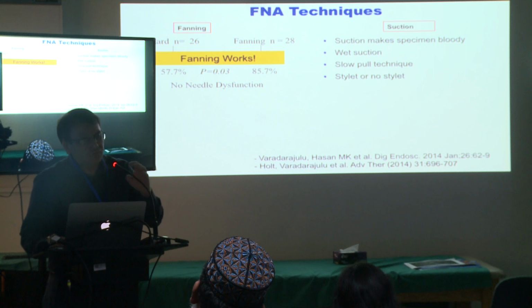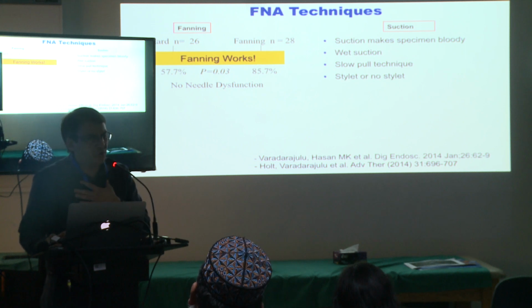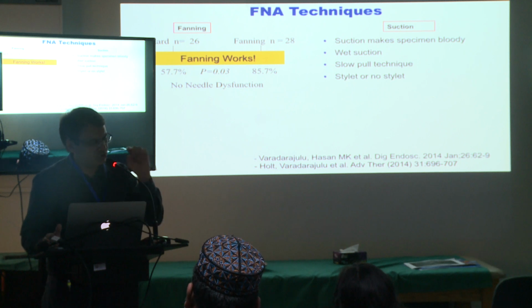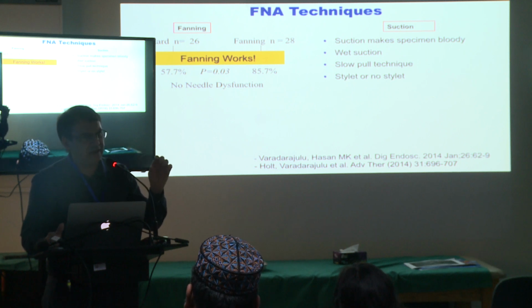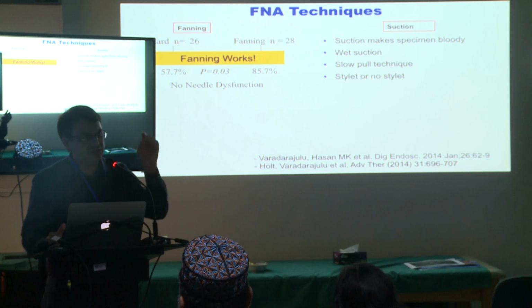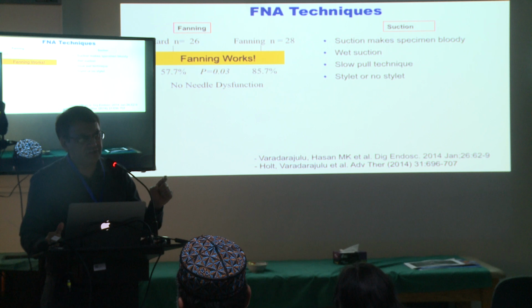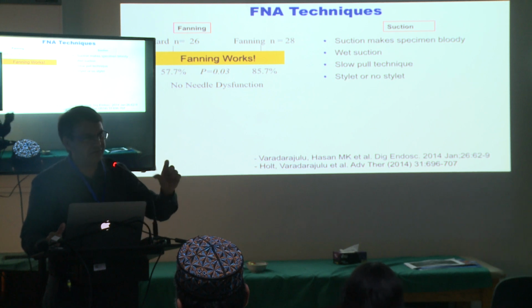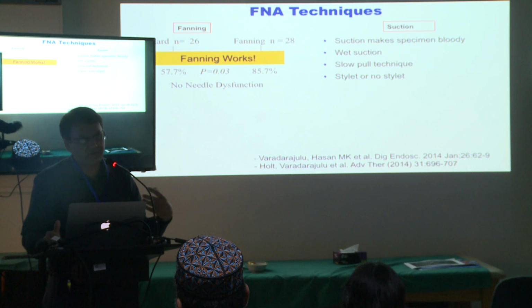Suction. For solid lesions, my goal is always not to use suction. If I don't get a specimen on the first pass, I will still make the second pass without suction. If I don't get it on that, then I use suction. I mentioned earlier, I use it a different way. I use an intermittent suction. Most people use either half suction or full suction, whatever works for you.